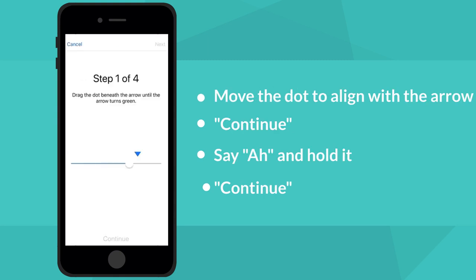To calibrate the sound on the SpeechFive app, slide the white dot to align with the triangle. Select Continue when the triangle turns green.